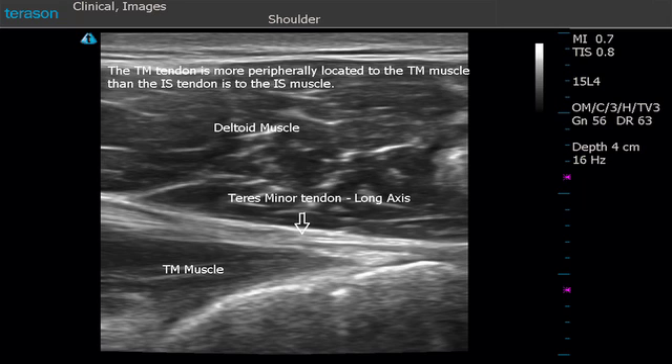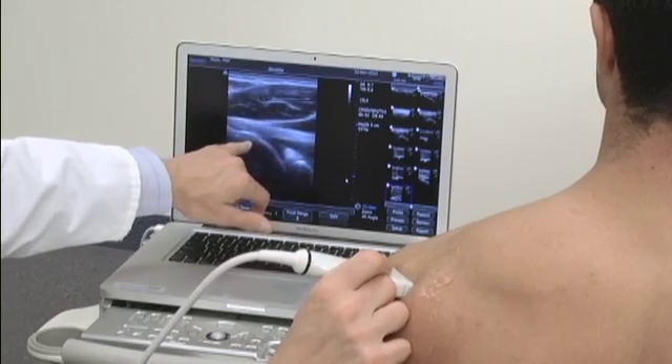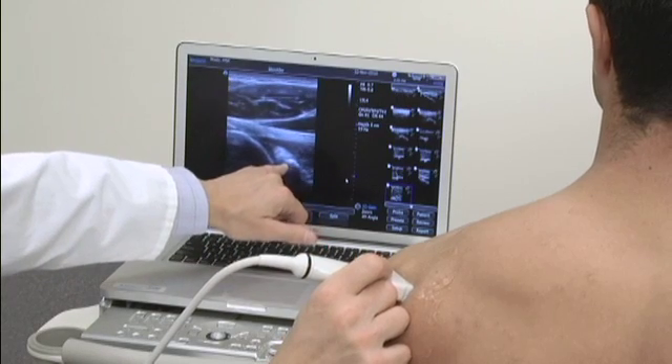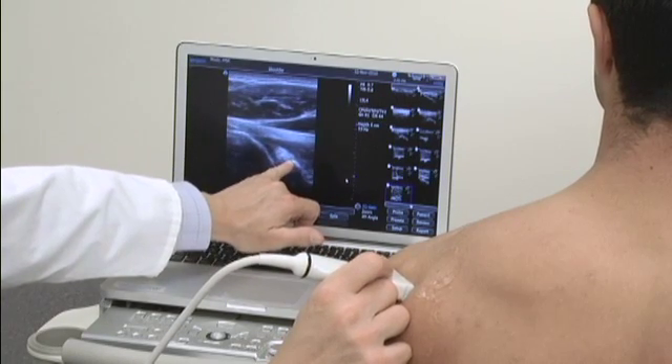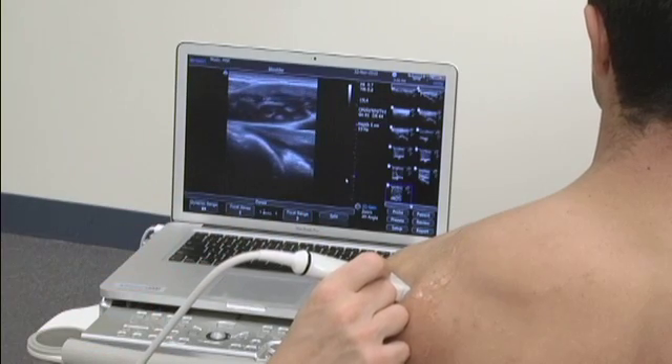In the same area, when we have the infraspinatus in view and slightly oblique the probe, we'll see the head of the humerus with the articular cartilage and the glenoid here. That little bright spot is the bone of the glenoid, and just on top of that, that bright area represents the glenoid labrum.